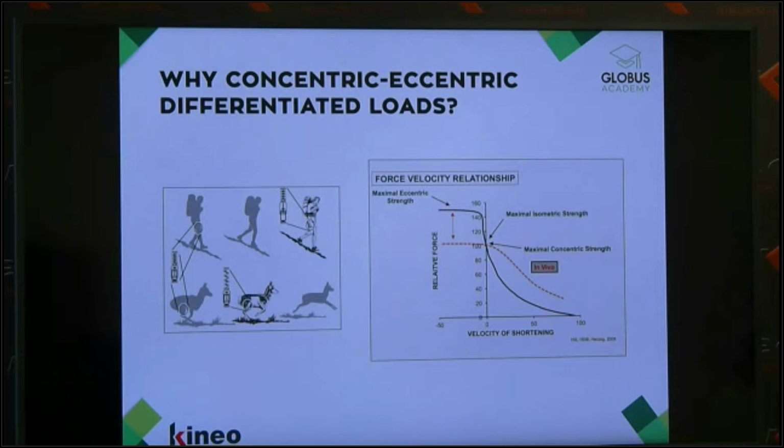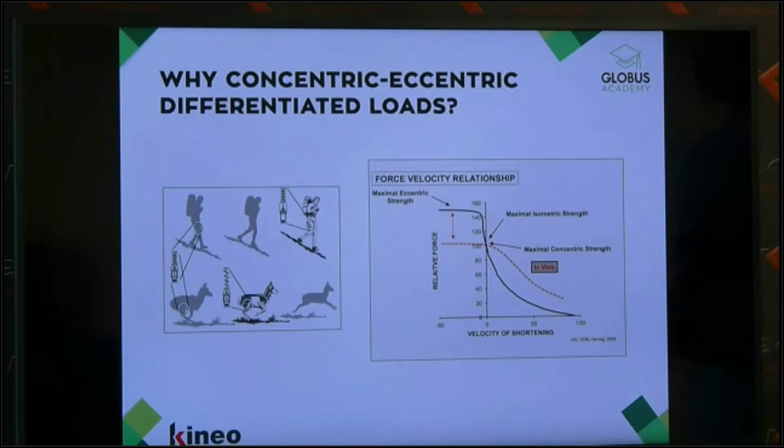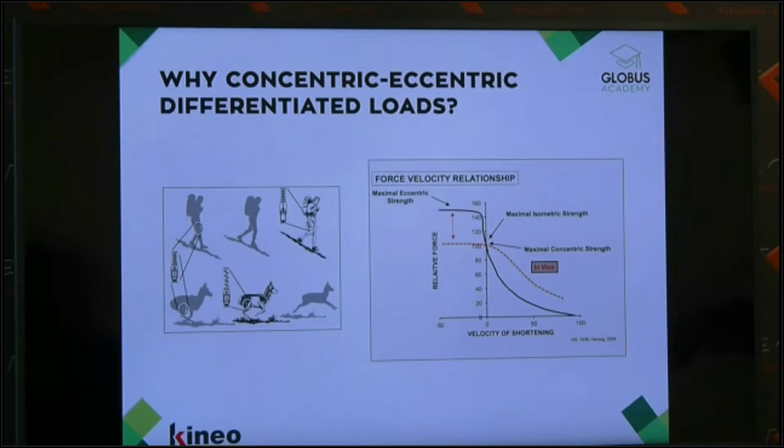This was, again, a very basic principle, maybe too easy, maybe not complete enough to properly explain how eccentric works. But this was the first time we saw this type of explanation. And as well, then we knew about strength, about the stretch-shortening cycle, and what kind of role eccentric will have in movement and in performance.